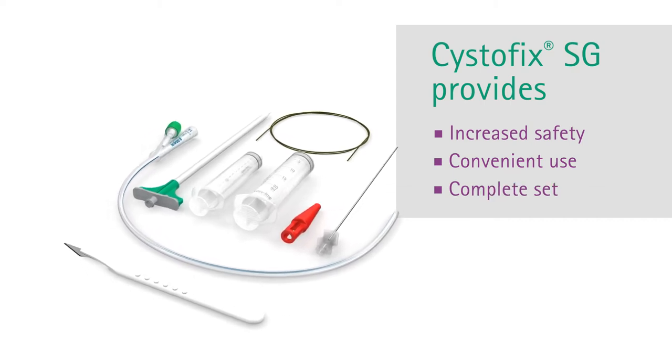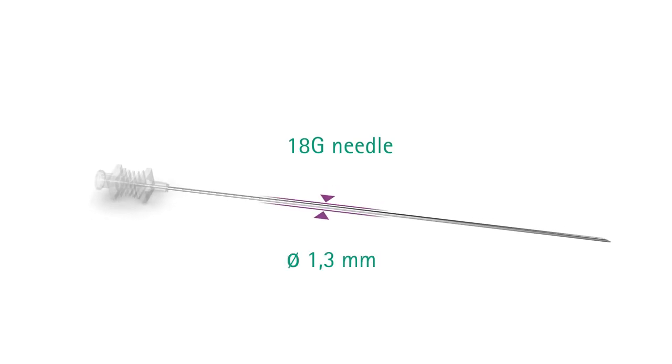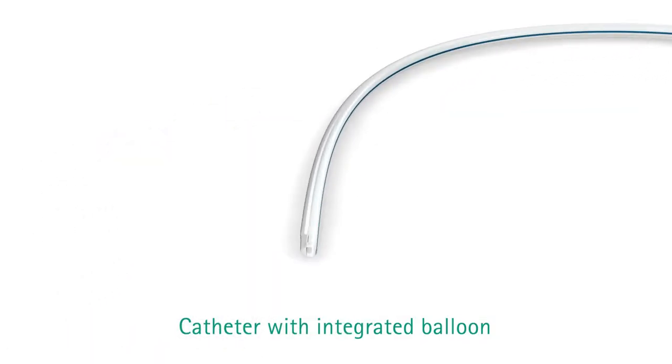Systofix SG is delivered as a complete set. This includes a needle with a small diameter, one dilator with a splittable sheath, and one silicone catheter with an integrated balloon.